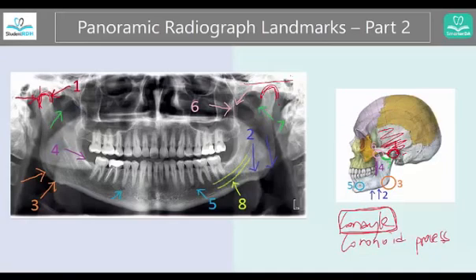This part towards the edges of the radiograph is the condyle, whereas the coronoid process is going to be a structure that's more towards the midline. We're already giving you the answer to number six, but this is how we remember it.